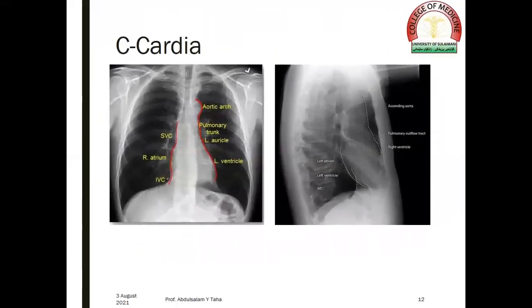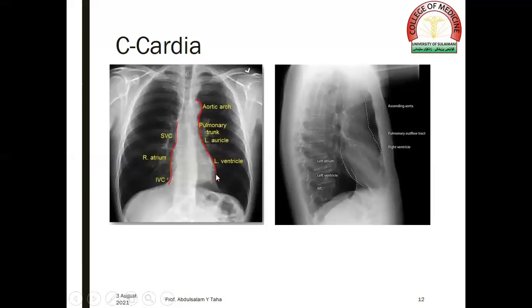If we look at these chest radiographs, on the left side we see that the right cardiac border is formed by the right atrium, above which is the SVC and below which is the IVC. On the left side, the left cardiac border is formed by the aortic arch, followed by the pulmonary trunk, then the left auricle, and finally the left ventricle. In the right lateral view, we see that the right ventricle is located anteriorly, and at the posterior aspect of the cardiac shadow we have the left atrium and left ventricle.